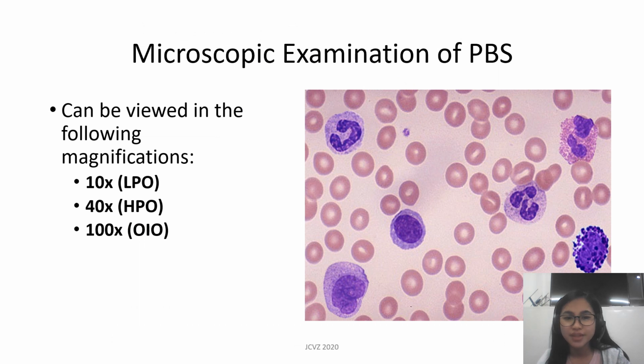So we're done with the macroscopic examination of our peripheral blood smear. We now go to the microscopic examination of our peripheral blood smear, which is the most interesting part.